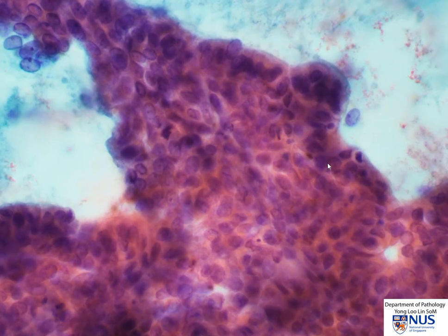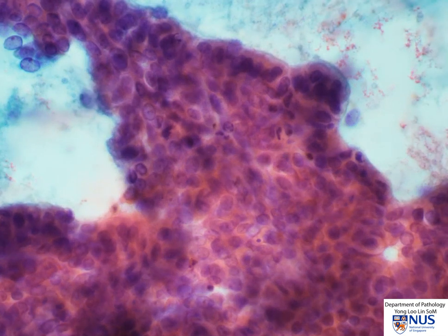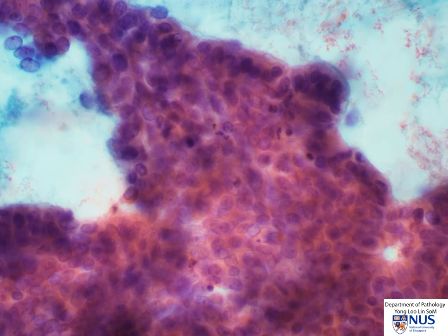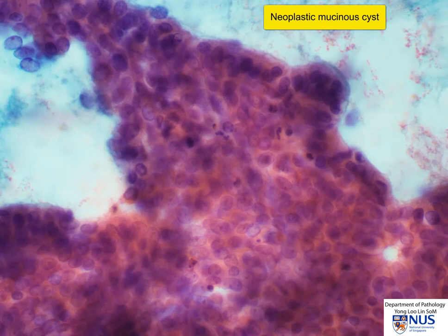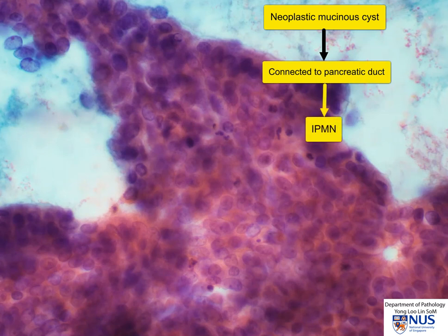We can see the mitotic figure more clearly here — mitoses are actually quite easy to identify. Therefore, this cystic lesion in the pancreas is likely to be a mucin-producing cystic neoplasm. And because of the presence of a connection to the main pancreatic duct, this is most likely to be an IPMN. Looking at the cytomorphology, there are no definite high-grade features here. So the diagnosis can be given as IPMN with low-grade cytologic atypia, no definite areas of high-grade atypia. This is helpful to clinicians in their planning of management in terms of whether resection is indicated.